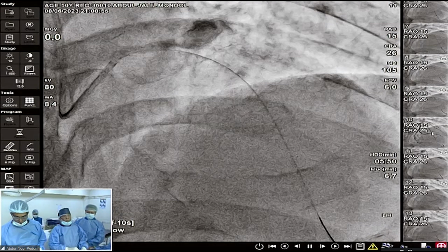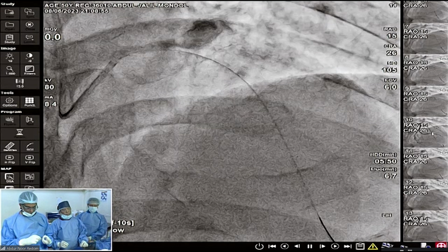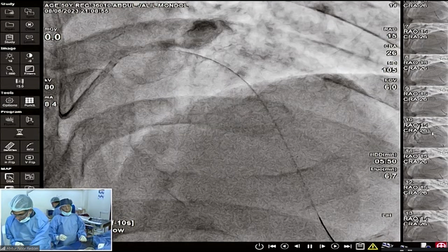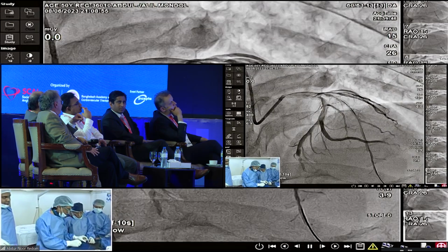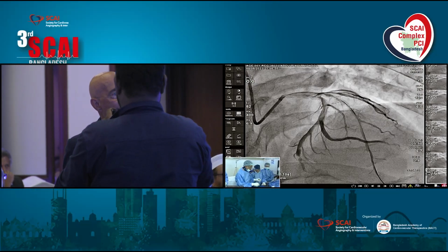Sivan, what is your opinion, please? Regarding the diagonal, would you like to protect it? Because our Dr. Dattu is concerned about the diagonal. It looks like 2, but I think after 5 minutes it will become 2.5 or even 2.75. Yes, for that reason we are going to save the diagonal, and we are going with another floppy wire to the diagonal.